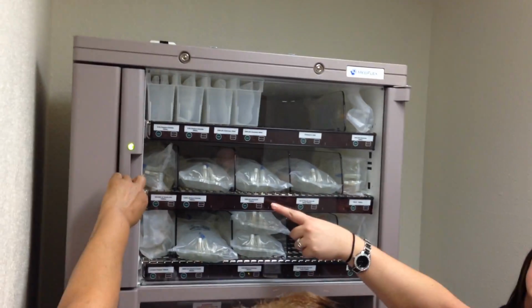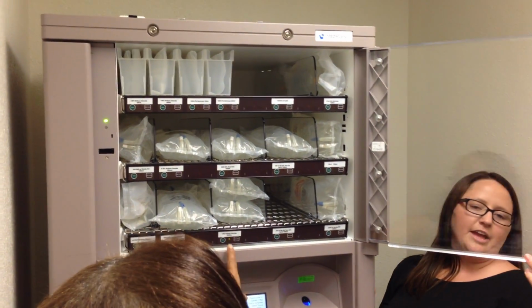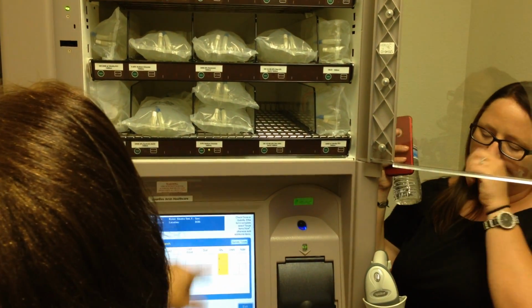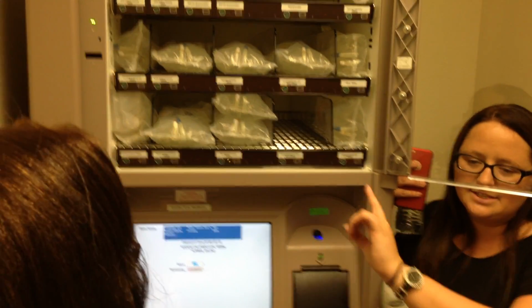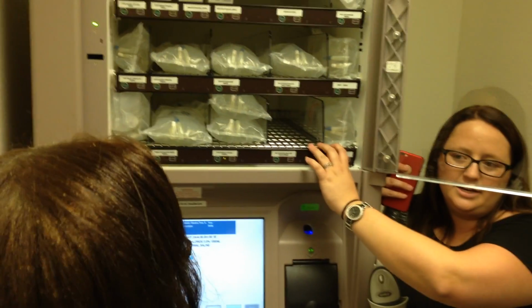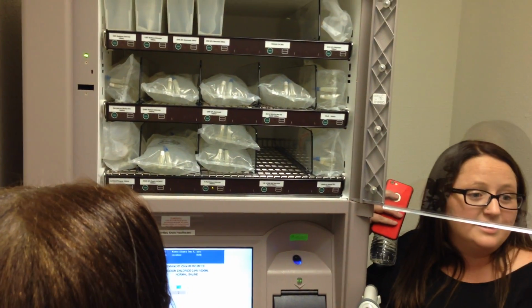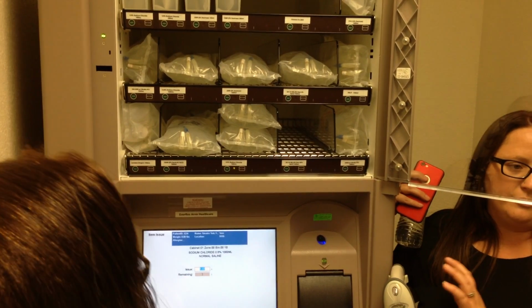Okay, so you'll open that up. You'll see how the light is lit up green too. So you open that up, and the appropriate spot is flashing. Watch your head. So you'll hit the green take button. You guys, this green take button is important, because that just indicated to me that you're actually taking it out. Okay, there's no shopping up here. So if you get in here and you realize you would really like a 100 ml bag too, that's great. Get back in here and tell the machine you're taking it out. I have no idea that you're taking it out if you go shopping.